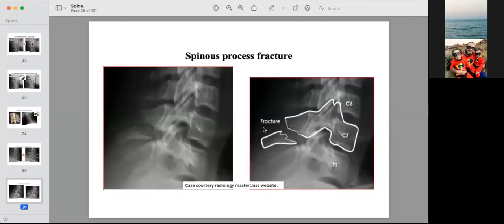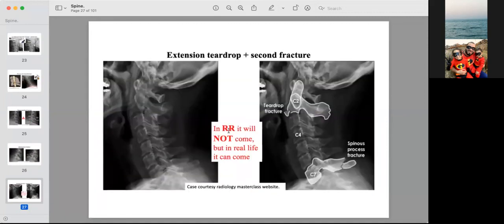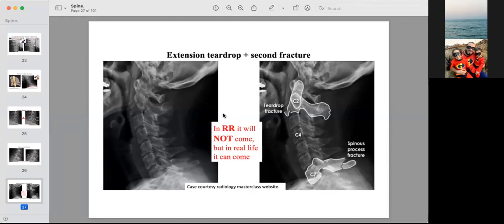A simple but easily missed fracture is the spinous process fracture, especially on the lower cervical vertebrae. In the rapid reporting exam, usually only one fracture will appear, but in real life — and in vivas — multiple fractures can be present. Do not satisfy your search by finding only one pathology and ignoring the rest. Always count all vertebrae on the lateral view; if C7 is not seen, the radiograph is inadequate and should be repeated, as hidden fractures can occur there.